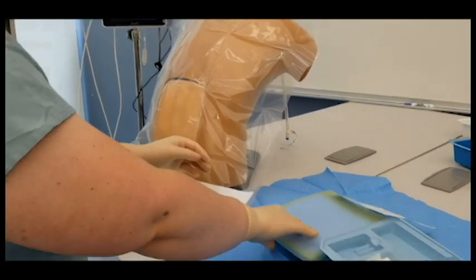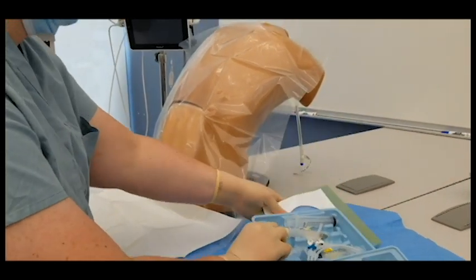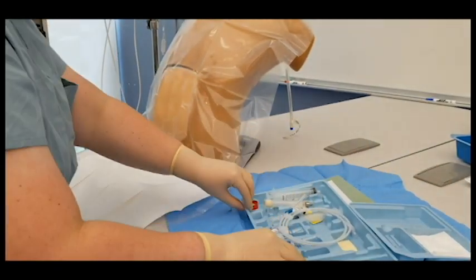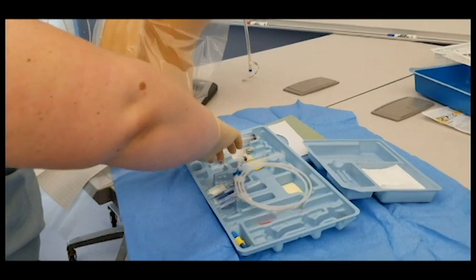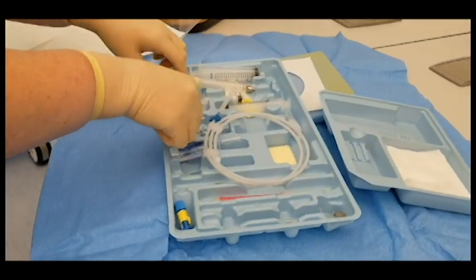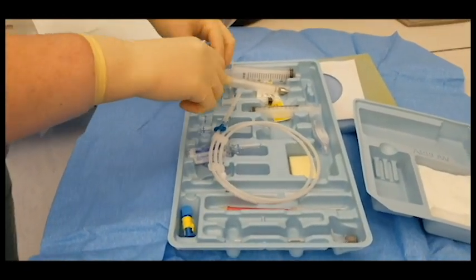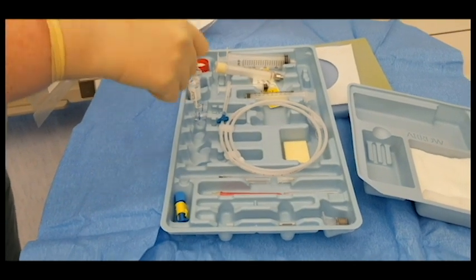Organize your kit and put away items to the side you will not use. Break the glass ampules away from your sterile tray and draw up about 3 cc's of 1% lidocaine for your skin wheel.